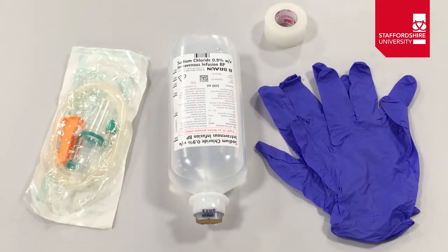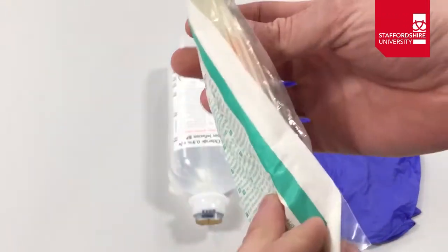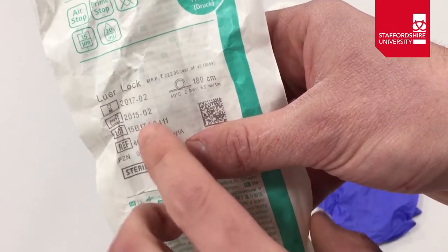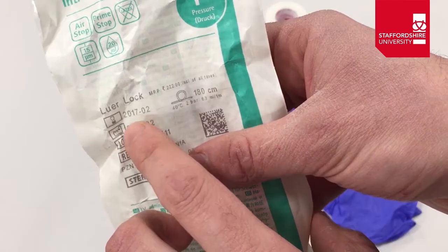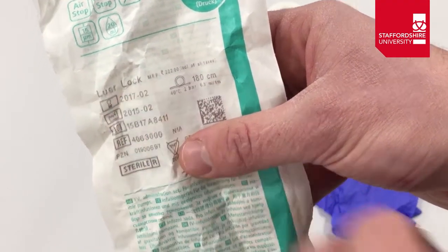The first thing we need to do is our standard checks. Looking at the giving set, we need to check package integrity — just make sure it hasn't been opened previously. We're then going to check the expiry date. You can see two dates: the manufacturing date of February 2015 and the expiry date of February 2017, so we'll confirm it is in date at the time of administration.